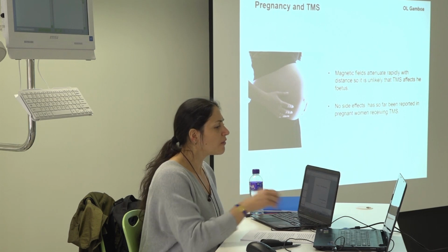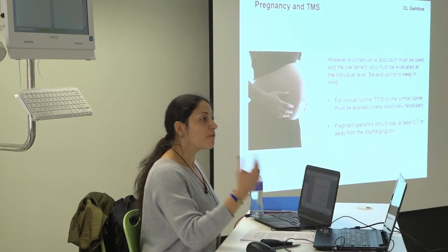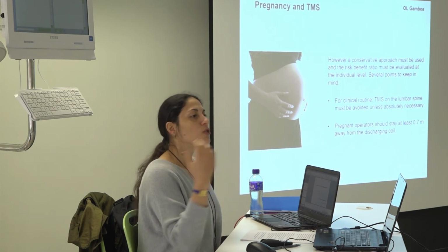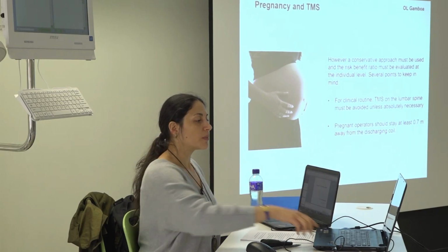And definitely what you will never, ever, ever do is to do TMS in the lumbar spine for a pregnant woman. You will never do that. If you have to do it because the benefit of applying TMS is higher than the risk to the person, which we don't know if there is any risk, but if you say it will really be good for the person and it will be a benefit, so you do it, right? But you will never ever do it in the lumbar spine. And what I said, operators should stay 70 centimeters away from the discharging coil.